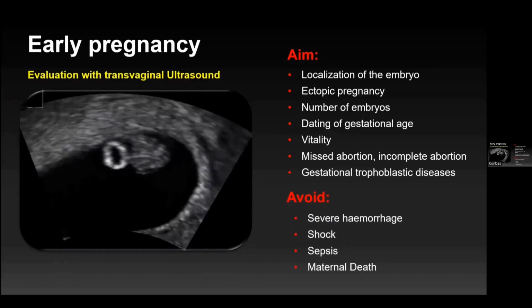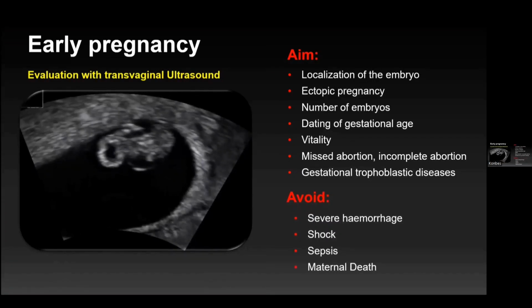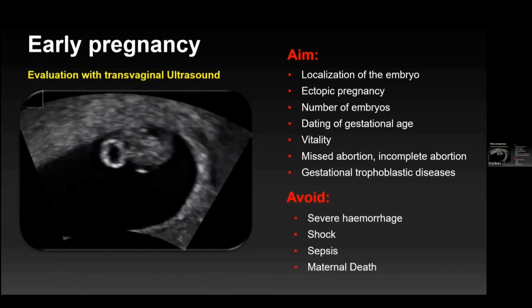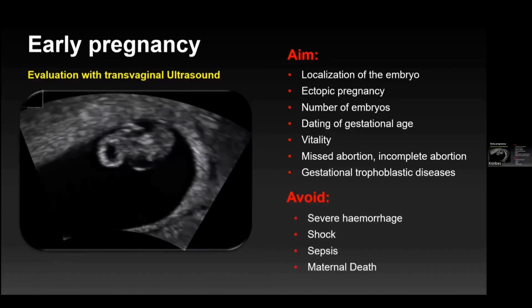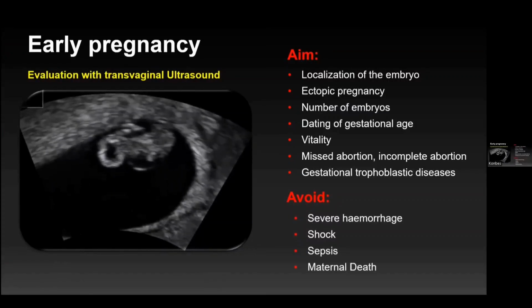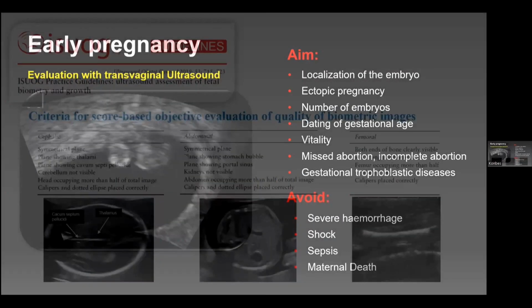And the aim is that we can avoid, in some severe diseases, severe hemorrhage, shock, sepsis, or maternal death. Also, we have a clear intrauterine detection of this pregnancy.